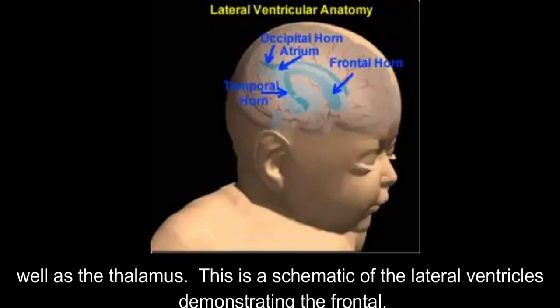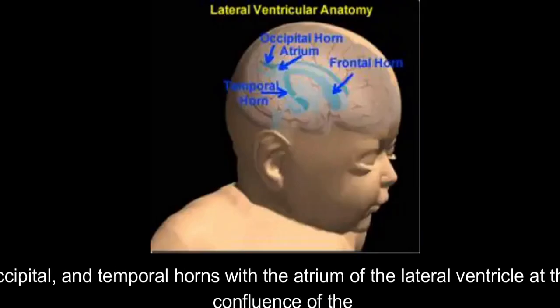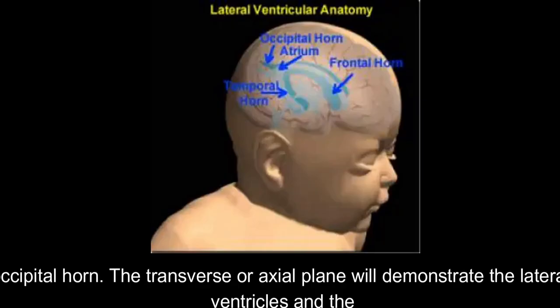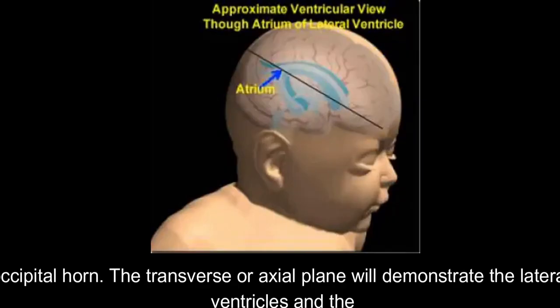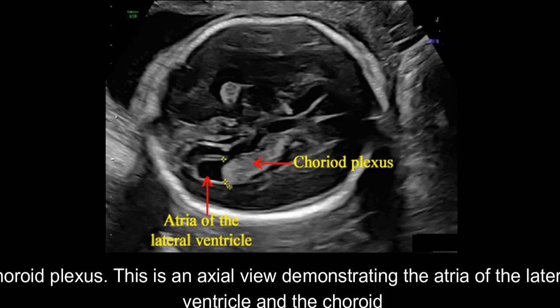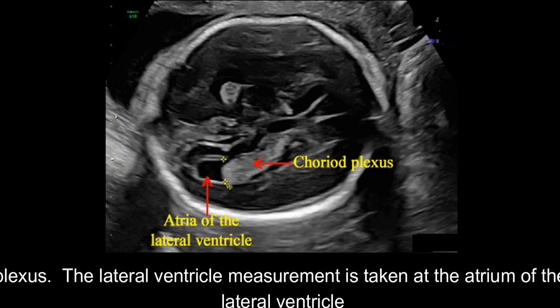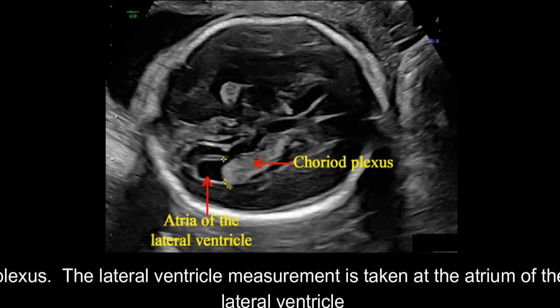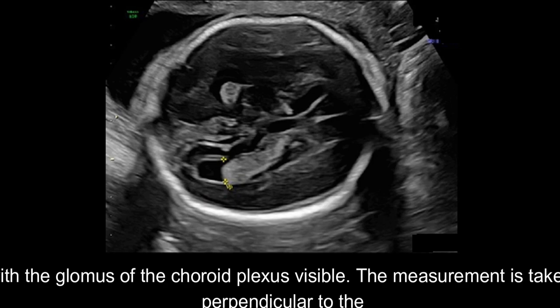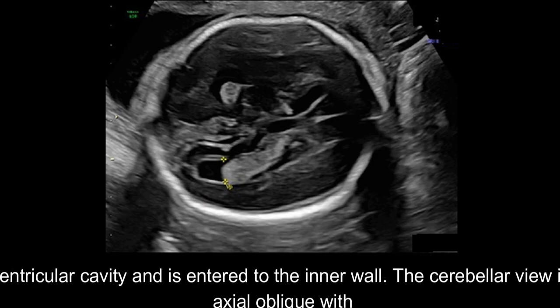This is a schematic of the lateral ventricles demonstrating the frontal, occipital, and temporal horns with the atrium of the lateral ventricle at the confluence of the occipital horn. The transverse or axial plane will demonstrate the lateral ventricles and the choroid plexus. This is an axial view demonstrating the atria of the lateral ventricle and the choroid plexus. The lateral ventricle measurement is taken at the atrium of the lateral ventricle with the glomus of the choroid plexus visible. The measurement is taken perpendicular to the ventricular cavity and is inner to the inner wall.